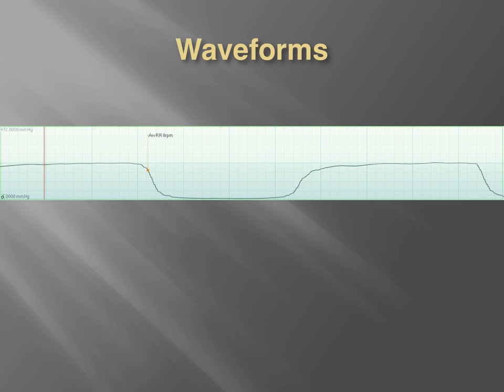So what we have here, like I just said, is a respiratory rate of 8 per minute, but also a normal waveform. And if we look at this reading here, I'm a little bit off, but this center line is going to be 35 millimeters of mercury. Okay, so when we're looking at most of our strips today, these are pulled from a computer, so a little bit more clean and crisp. The orange ones are our standard strips that have been scanned in or what have you.